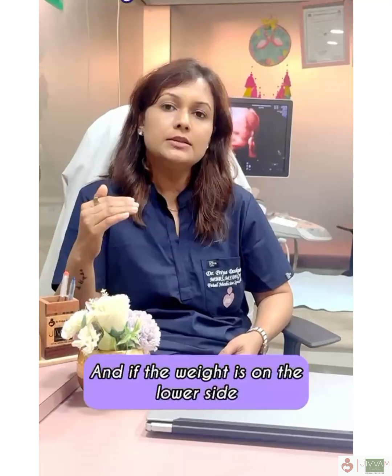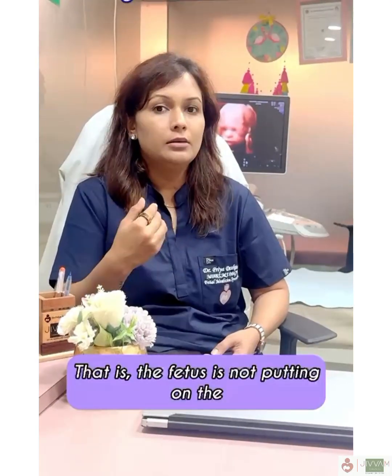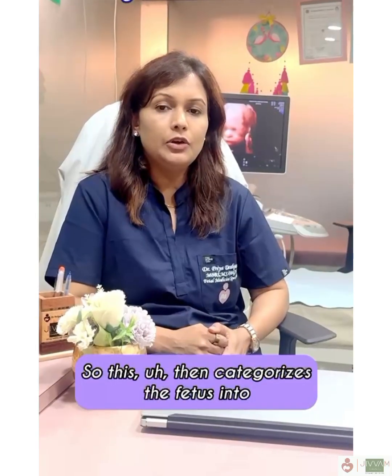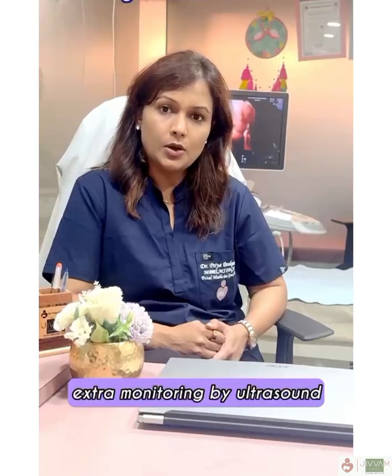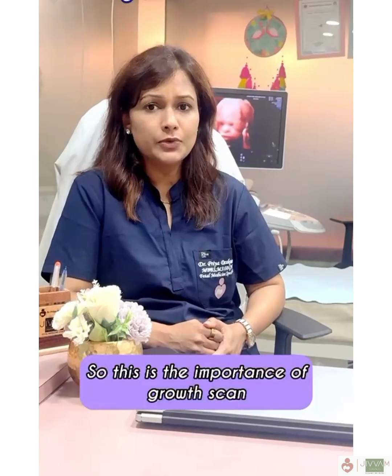And if the weight is on the lower side, like 5th centile, 10th centile, then that is alarming because it suggests that there is a growth problem. That is, the fetus is not putting on weight as per expected normalcy. This then categorizes the fetus as fetal growth restriction. Now, these fetuses will need extra care, extra monitoring by ultrasound, maybe weekly or 2 weekly, and that will also need additional Doppler evaluation and monitoring. So this is the importance of a growth scan.